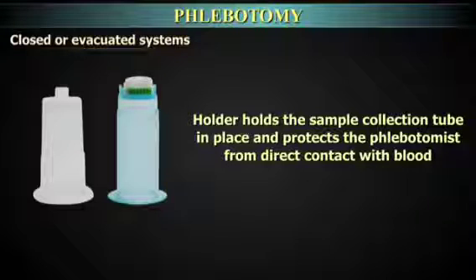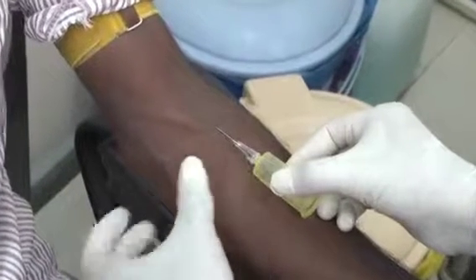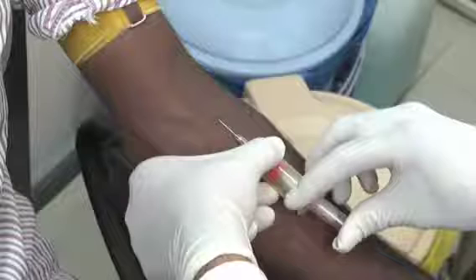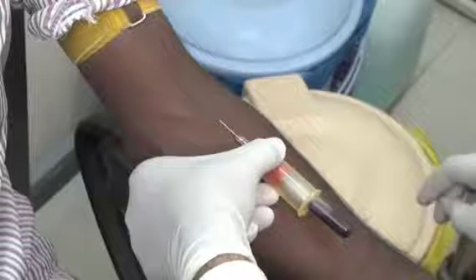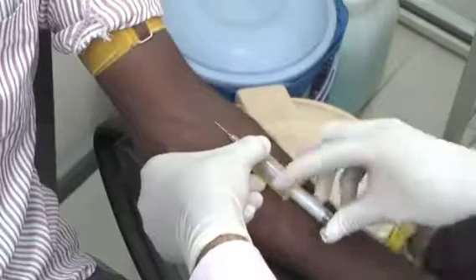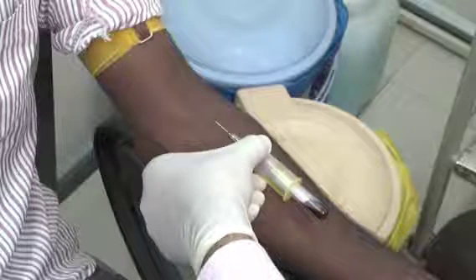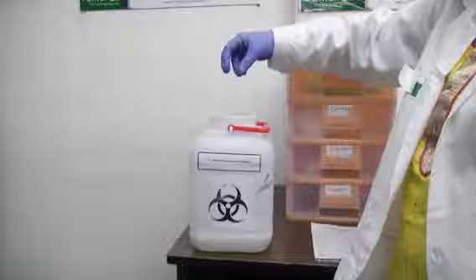The holder holds the sample collection tube in place and protects the phlebotomist from direct contact with blood. As the sample tube is under vacuum, once the needle is in the vein, the tube is pressed onto the non-patient end of the needle in the holder and blood is drawn automatically into the sample tube by vacuum until the required amount is collected. The next tube is then placed in the correct sequence without removing the needle from the patient. The needle and holder are to be discarded as a single entity.